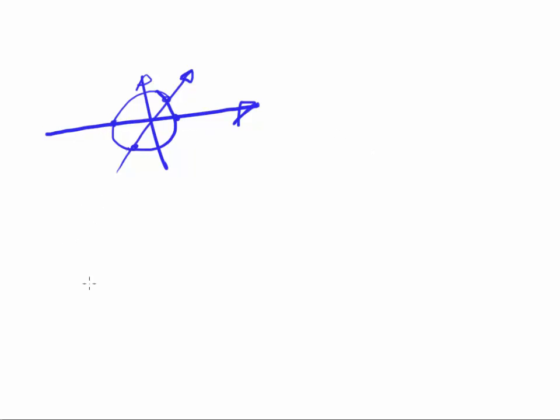These magnetic fields, by the way, are called gradients because they actually form a gradient along the main field, lesser on one side and stronger on the other side. But this field is actually linear. This is a very complex process, but by controlling the gradient fields and the corresponding RF transmit signal, we can create differences in the received signal depending upon where in space that signal is coming from. These differences can be plotted in the phase and frequency direction.